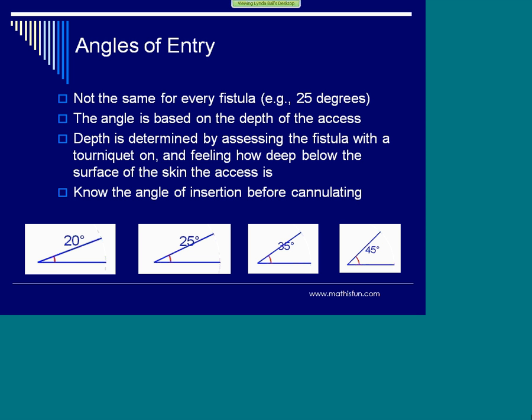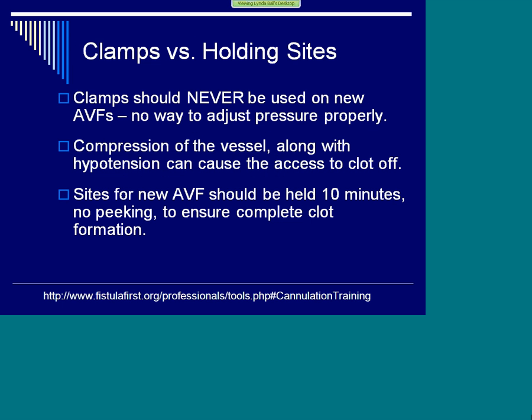Also, if you over-rotate your angle of insertion, you can stretch the opening in the surface of the skin, but you also stretch the opening into the blood vessel. And then when you heparinize the patient, they can ooze out into the tissues during dialysis. And they come back that next day, and they're all bruised. And what do we say to the patient? What did you do to your arm? It looks so awful. Well, it could have been something that we did to the patient and caused that bruising, because they look at you like, what do you mean what I did? I didn't do anything. And they truly may not have done anything. It was probably what we've been doing, and now we have to just pay more attention to that.